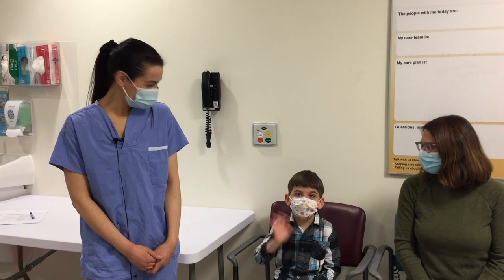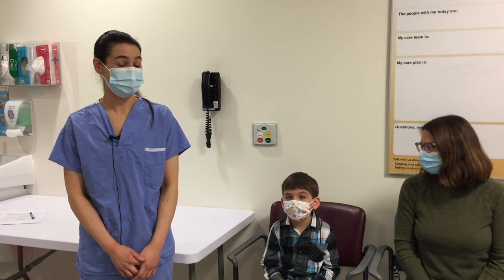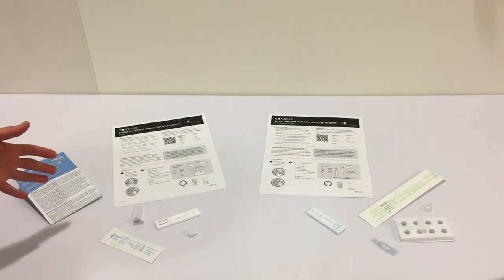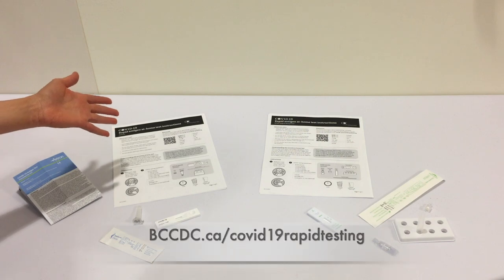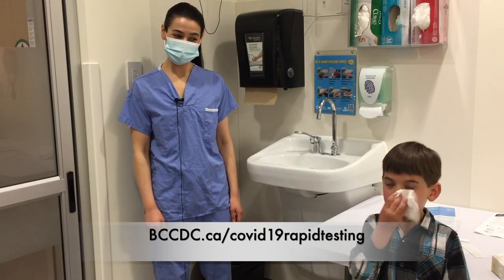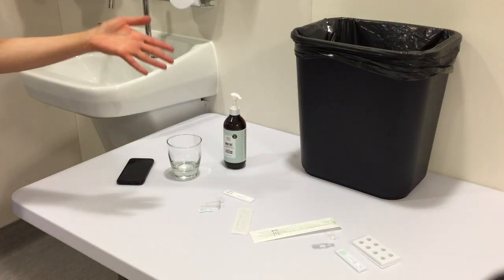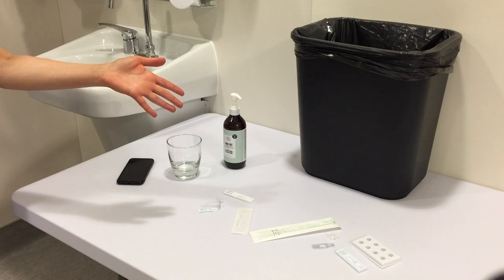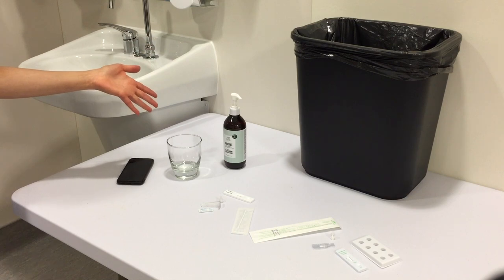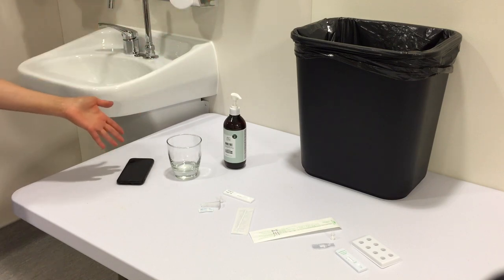This is Benjamin. For your test, you might want to have your child sit on a chair at your kitchen table or in your living room. Parents can get test instructions from the BC CDC Rapid Testing at Home website. Make sure your child blows their nose and you wash your hands before you start the test. You'll need the contents of your rapid test kit, which may vary. You may also need hand sanitizer, a cup, a garbage can, and a timer. Most phones have timers.